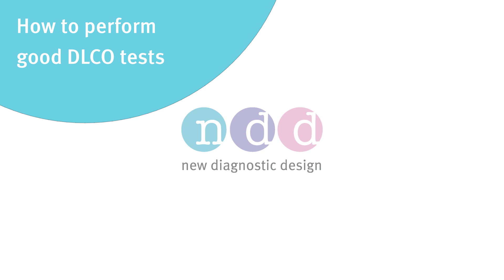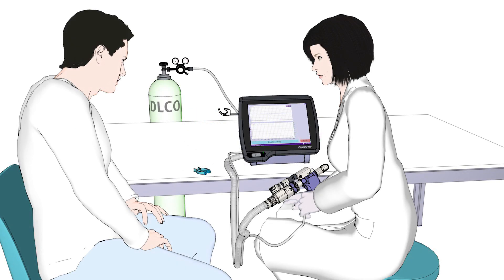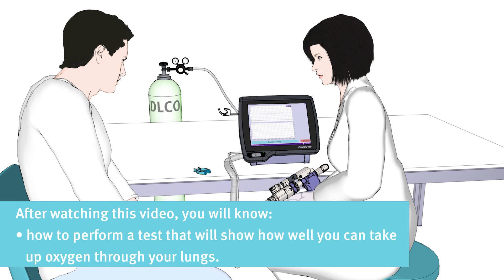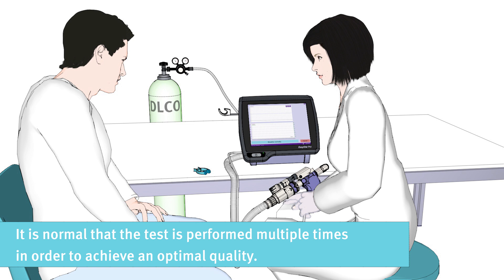How to perform good DLCO tests. Hello and welcome to this educational movie. Thank you for taking the time to watch this short video. After watching this video, you will know how to perform a test that will show how well you can take up oxygen through your lungs. The lung function test is dependent on your cooperation, and your doctor is very thankful for your effort. It is normal that the test is performed multiple times in order to achieve an optimal quality.